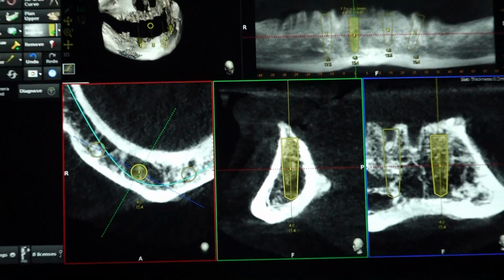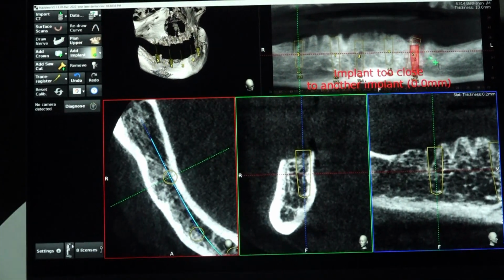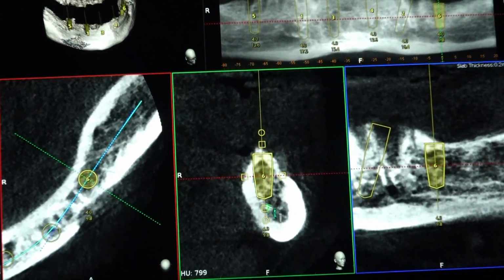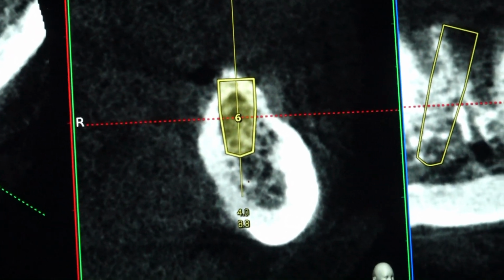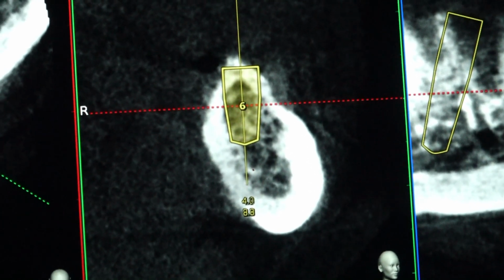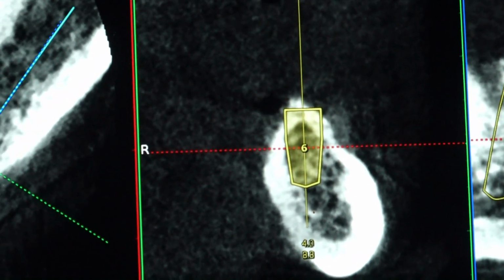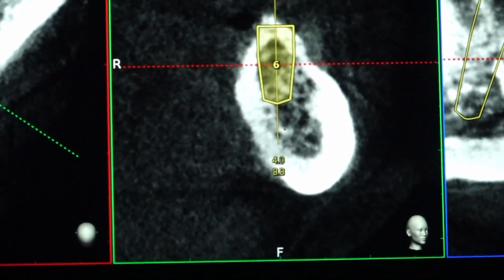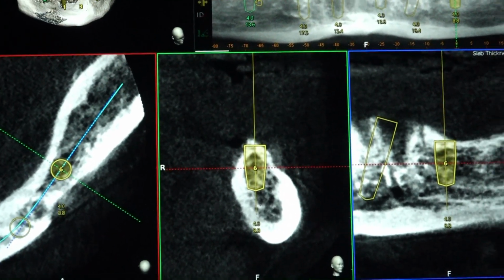Now after that we have to place one implant in the molar distal mandible. Where to place? Whether to place in the mesial root or distal root of the first molar or second molar depends upon where there is good quality bone. Minimum 10 mm is needed for a compressive implant, because you are going to place only one implant. It is better to select a wider diameter, 4.1 or 4.2 into 10 mm.